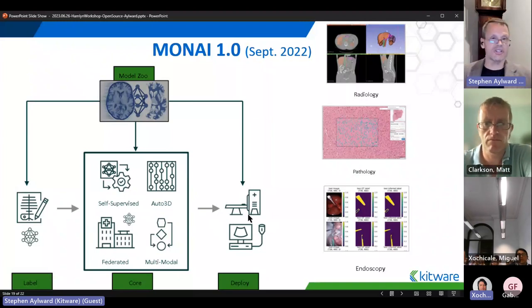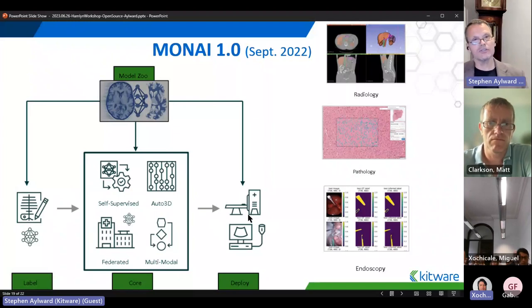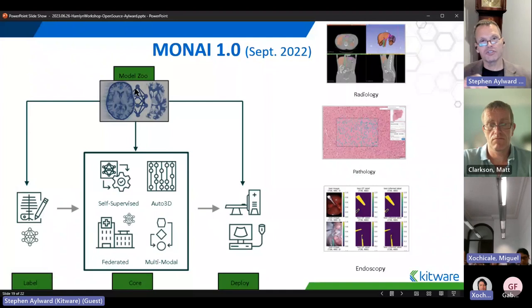And just as there were extensions within Slicer and the journal articles within ITK, Insight Journal, we have our dissemination system, which is the MONAI Model Zoo. And this Model Zoo has all these pre-trained networks. With the release of 1.3, which will be coming out right before MICCAI, we're emphasizing the MONAI bundle, which is your pre-trained model, making it really easy to contribute it to this MONAI Zoo and to use a model from the Zoo to run inference on your data, or as a foundation or backbone network that you then specialize for a particular task.